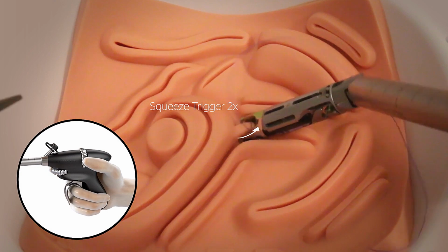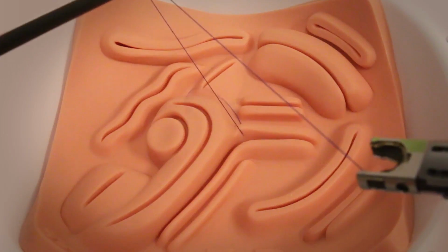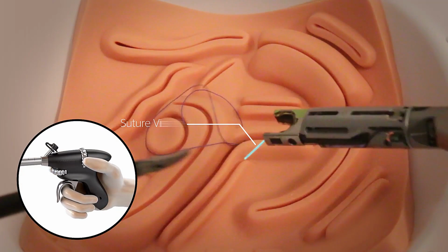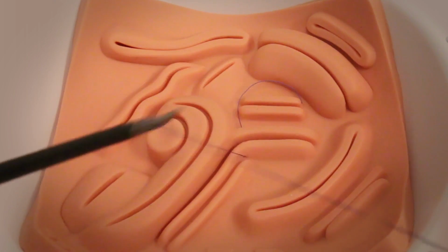Squeeze the trigger 2 times for complete 360-degree rotation of the curved needle to smoothly pass the curved needle through the tissue. After the second squeeze of the trigger, the curved needle is reset and ready for the next action. Gently pull the device away from the tissue. To verify the needle and suture have completely cycled through the tissue, the suture should be visible between the distal tip and the tissue. Tie a knot using your preferred knotting technique.